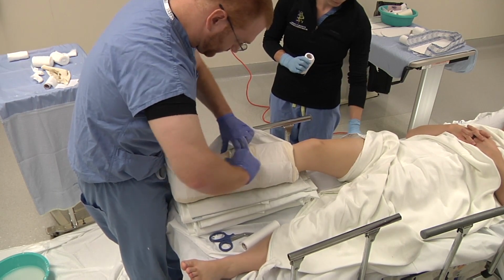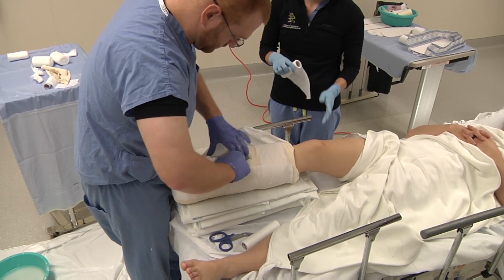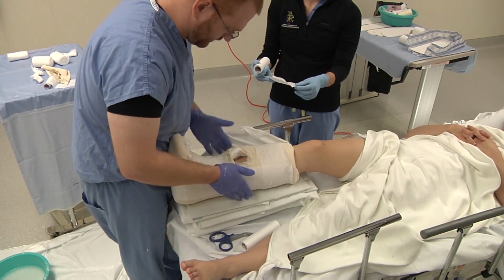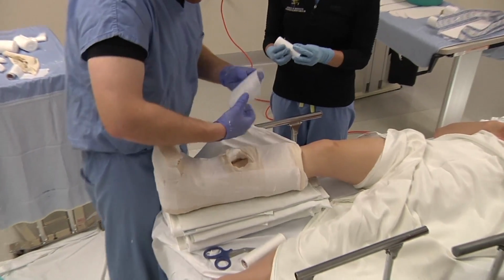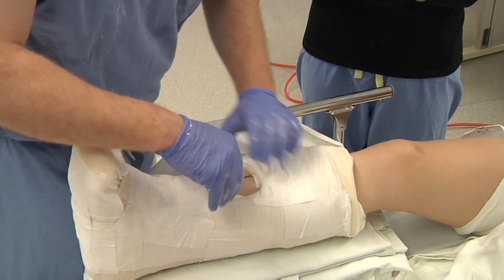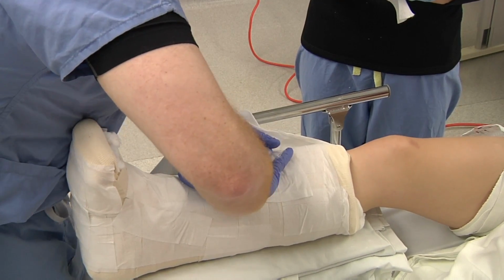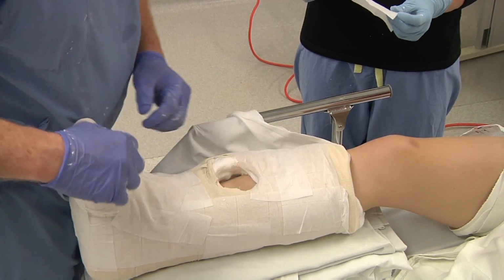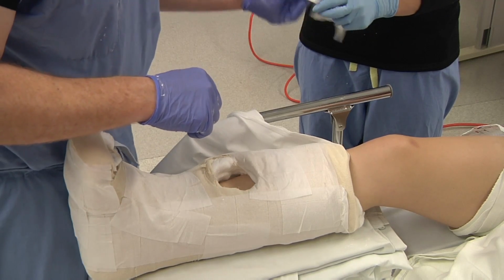Pull back your plaster to expose the tibia. From here you can somewhat adjust the plaster as it's drying to provide a window so that you can stick your fingers circumferentially around to feel compartments for any tense compartments. This is just one of the components of a compartment check.